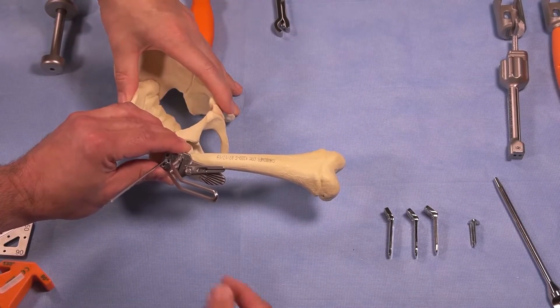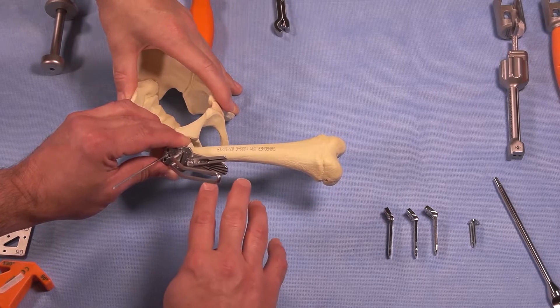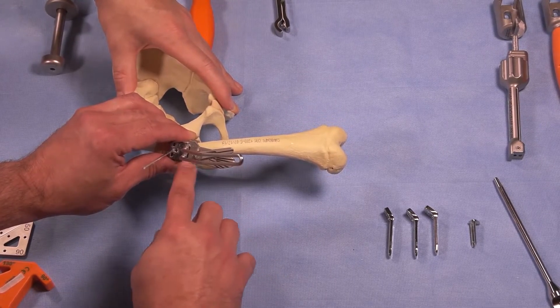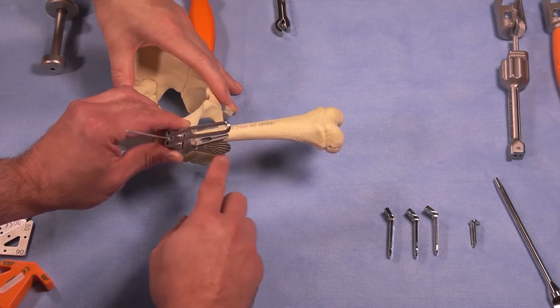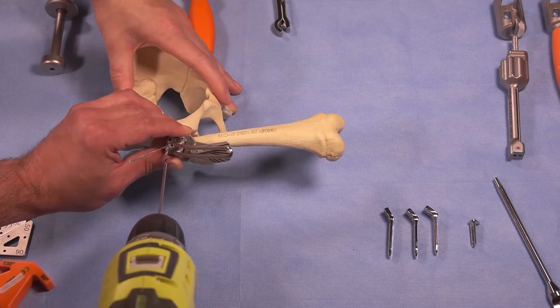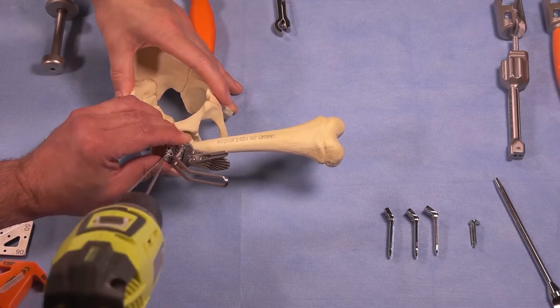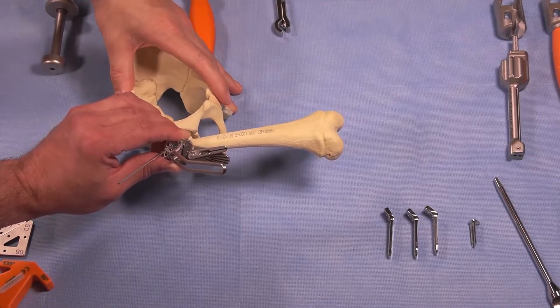The next step is to break the cortex using the cortex breaker. It has this flexion-extension guide. At this point, I'm going to extend the femur 20 degrees. If you align that with the femoral shaft, your blade plate is going to mimic this part of the guide, and you can see how much correction between the shaft and the guide is going to occur. With sawbones, you have to do multiple cortex breaks because the material is very hard in these demonstrations, though that might not be necessary in pediatric bone.